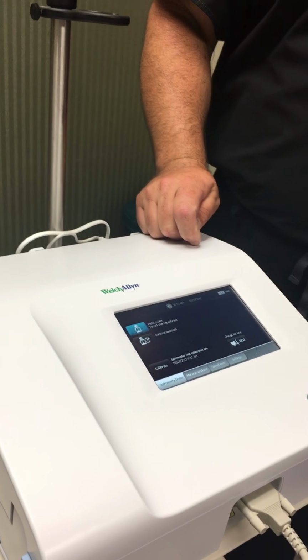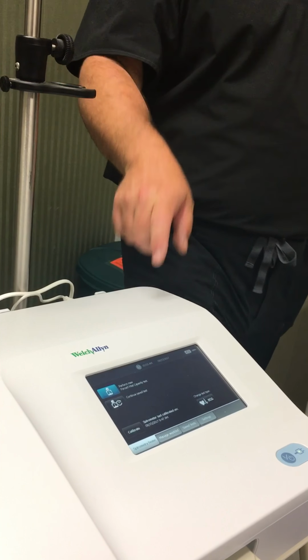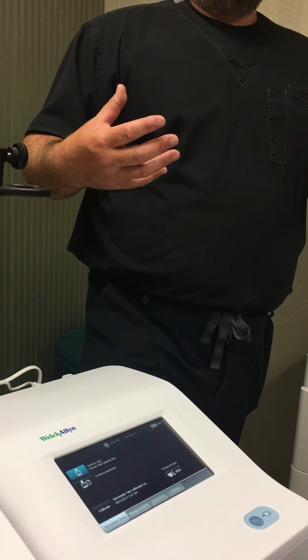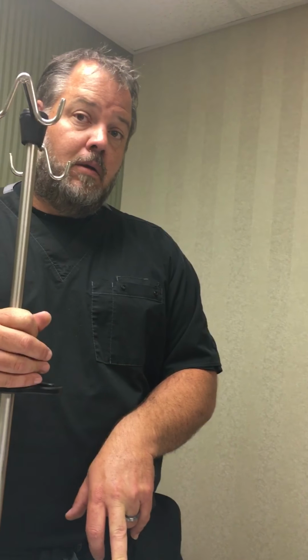Now, when you save that in there, how long does that stay on there? Until it's full. It'll say 40 tests total between EKG and Spiro. So if you know you're going to be doing a pre and a post, say you're going to do a pre and a post on me, and Anthony really needs the EKG, make sure you save it. If he walks out the door without you saving it, it's gone. You can't come back and add to it. It's not going to remember it. So you have to save it. Okay. So if nothing else, we should save the pre-test.